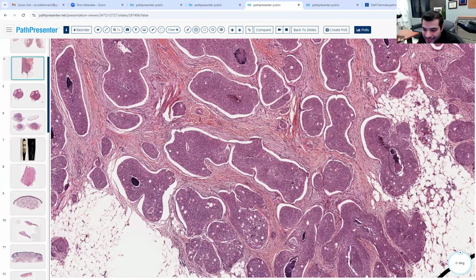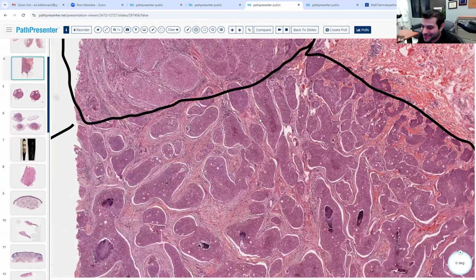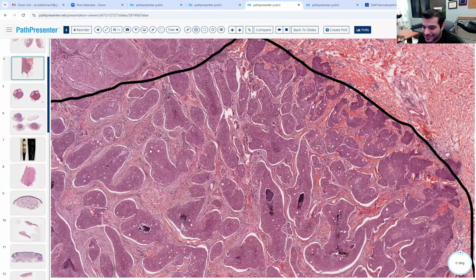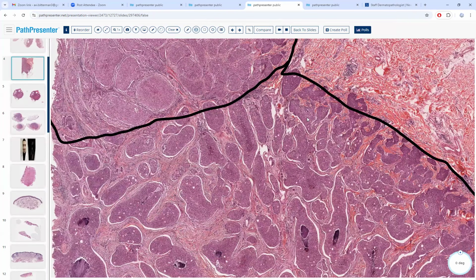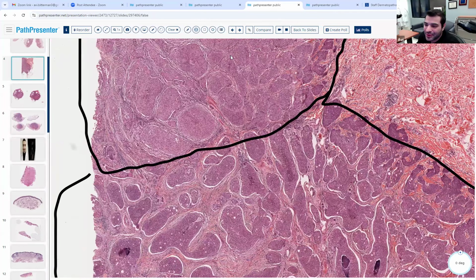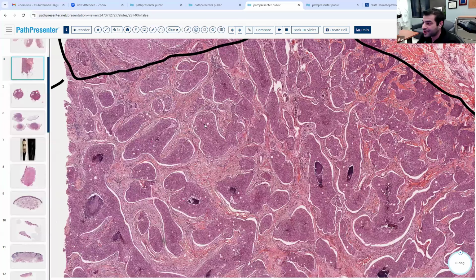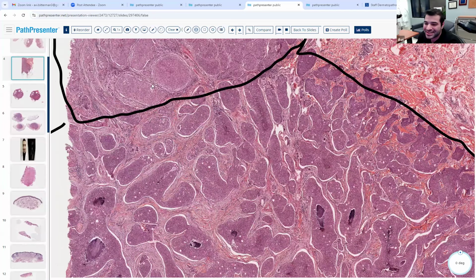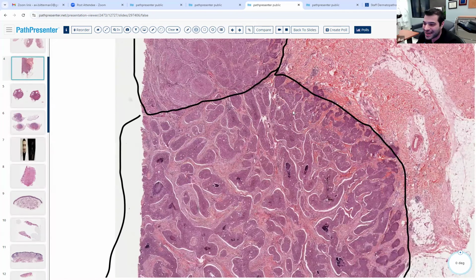I don't always find them, but tell me about how many ducts do you see between the poroma area and the porocarcinoma area? You seem to be more. It's very flagrant in its ductal differentiation. Yeah, so sometimes in these transformative entities where you have poromas into porocarcinomas, in some cases it just starts making a crazy amount of ducts. Usually in poromas, it's hard to find them. Don't judge it based on that.